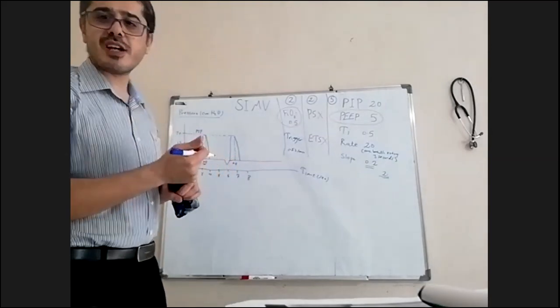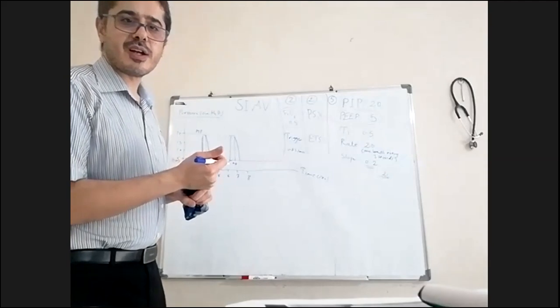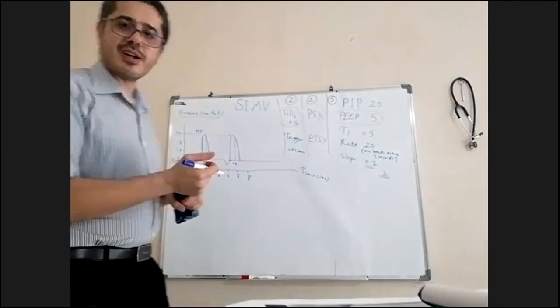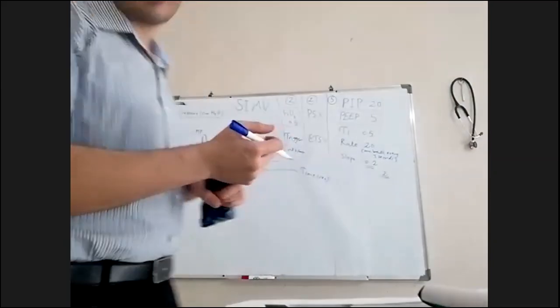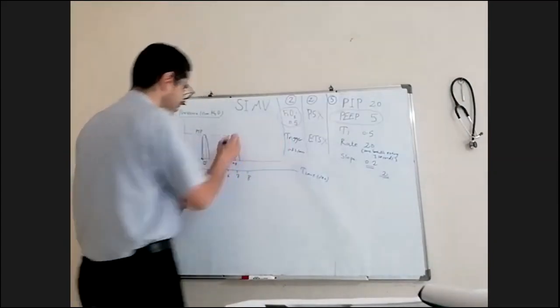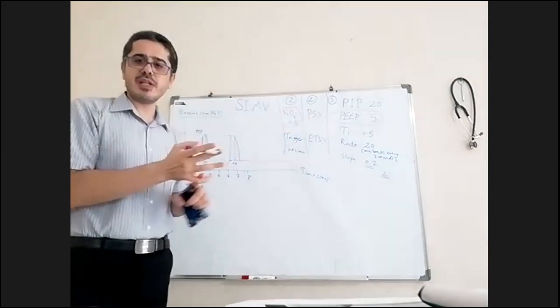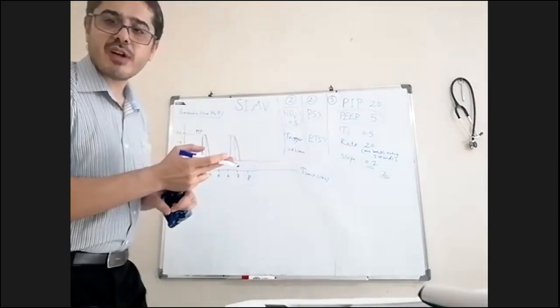Yes, what cycle? It is time cycle. Yeah, time cycle, because we have the TI, so controlled breathing and assisted breathing always have time cycle.